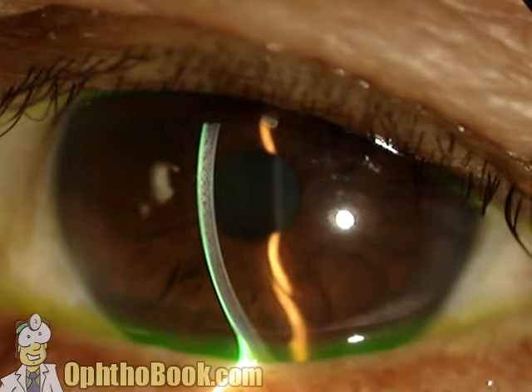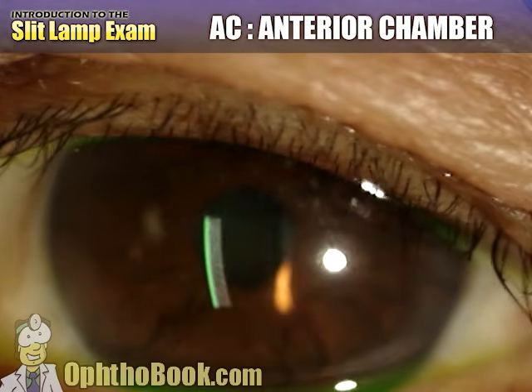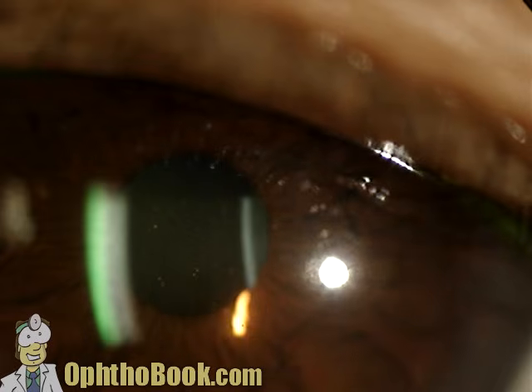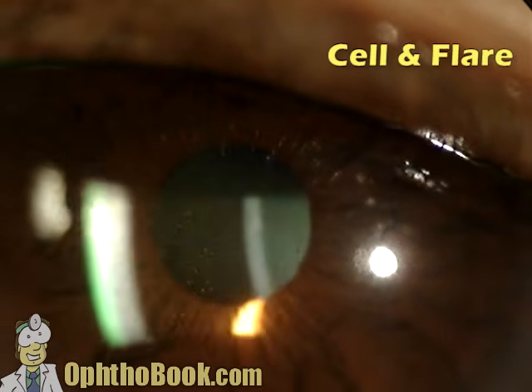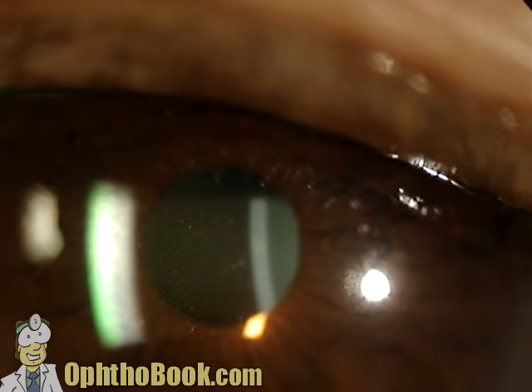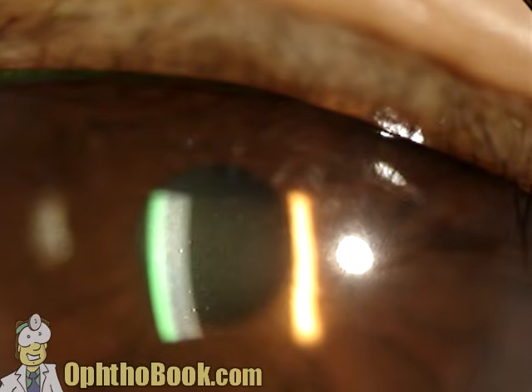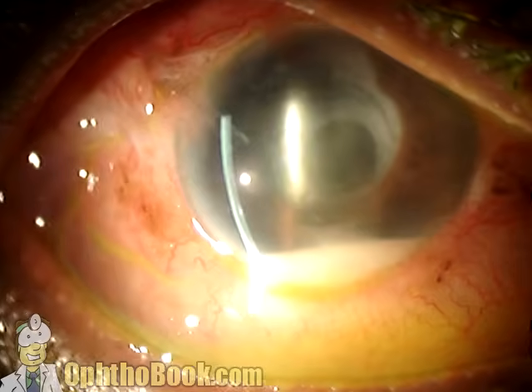This is the anterior chamber, and when looking at the anterior chamber, make your light beam shorter, a little bit thicker, and turn the intensity as bright as you can. And you'll see cell and flare. Cells are individual cells floating in that potential space there, and flare is that sort of foggy appearance from protein released from inflamed blood vessels. The brighter the light, the easier it's going to be seen. And if you use the pupil as a background, it makes it a lot easier. This is more flare, less cell, but you get the idea.